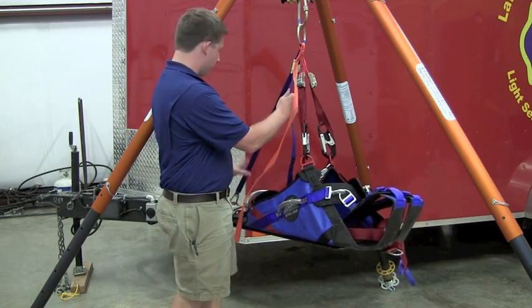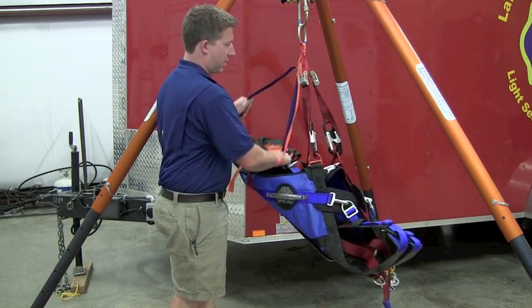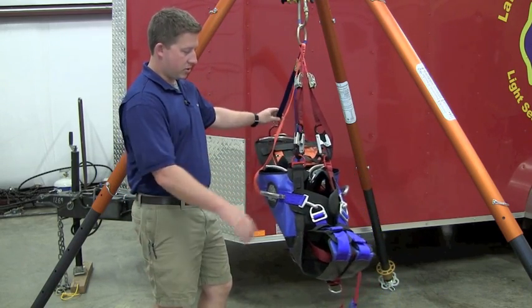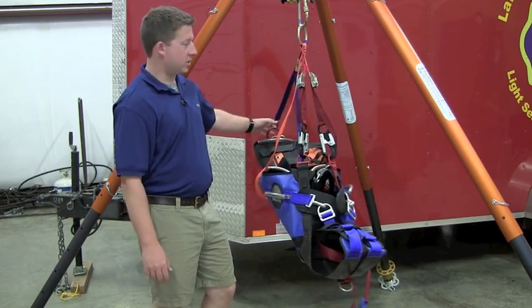So this is in the horizontal position, and to adjust the patient to make them sit more upright, all you have to do is move the strap up. It automatically locks just a cam, so now you can adjust their position the way that they're sitting.